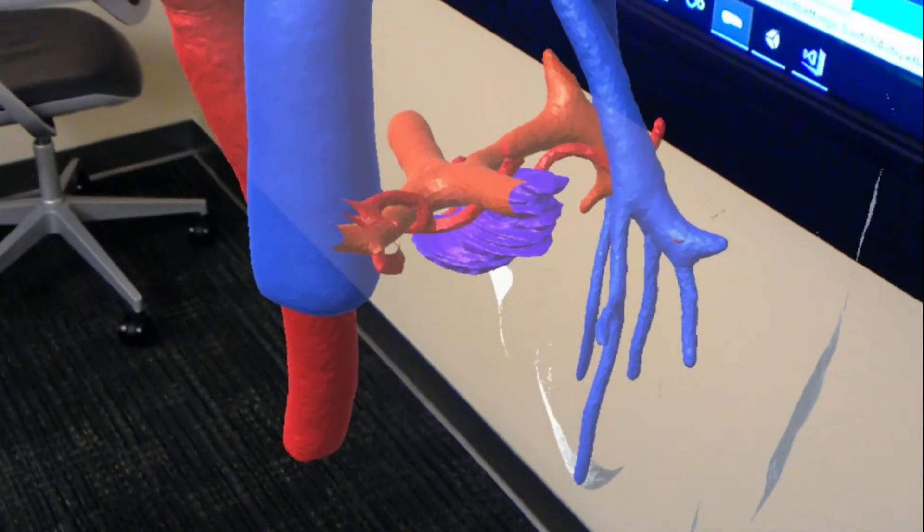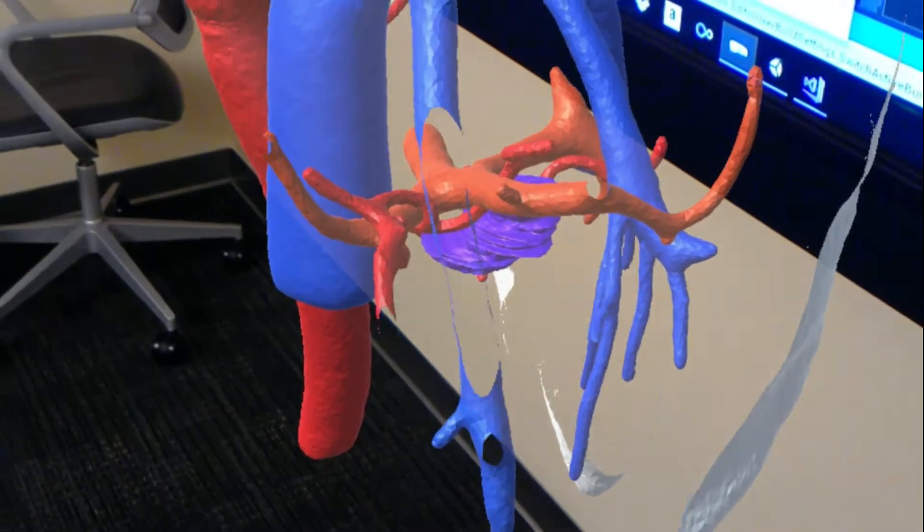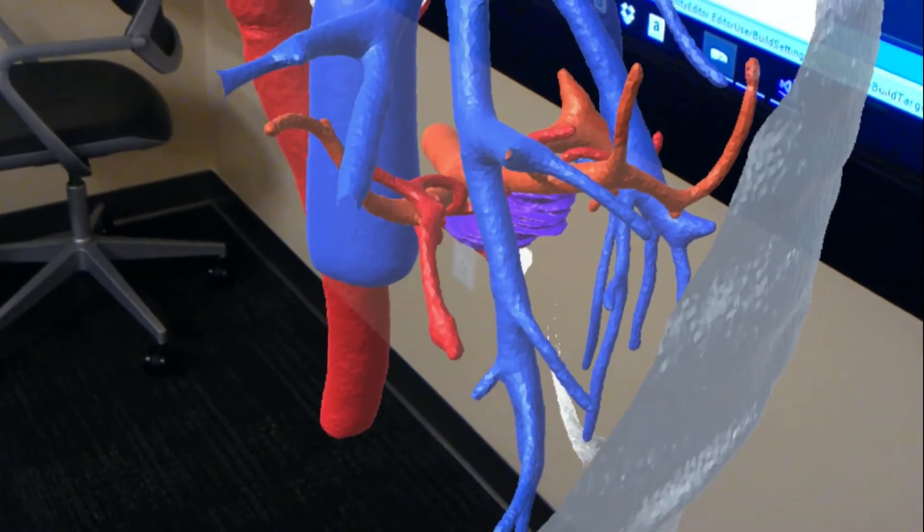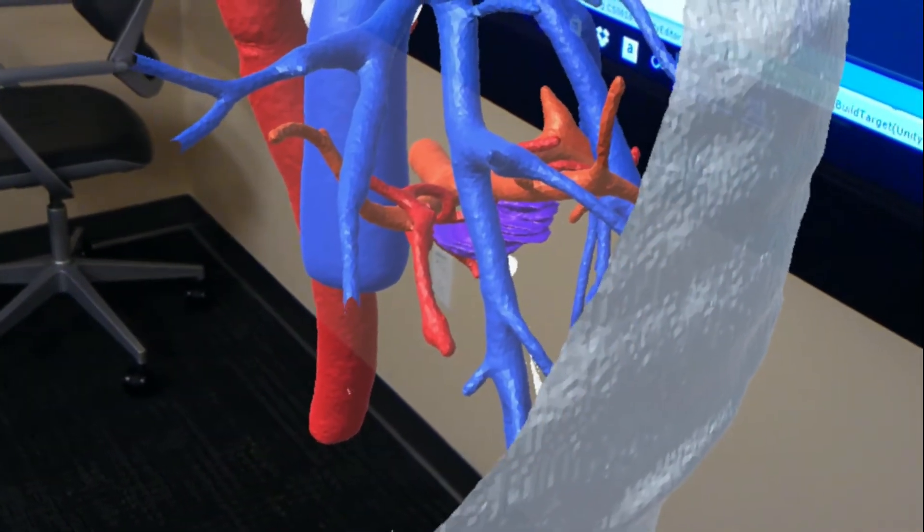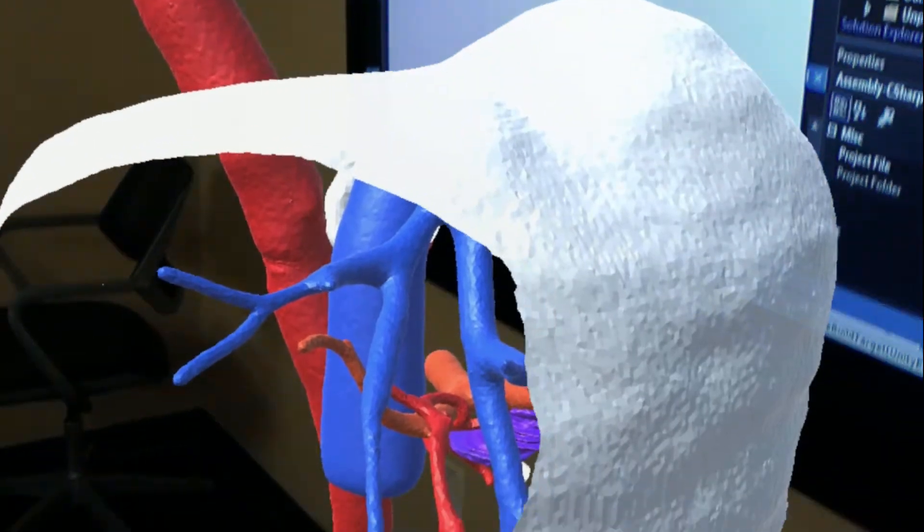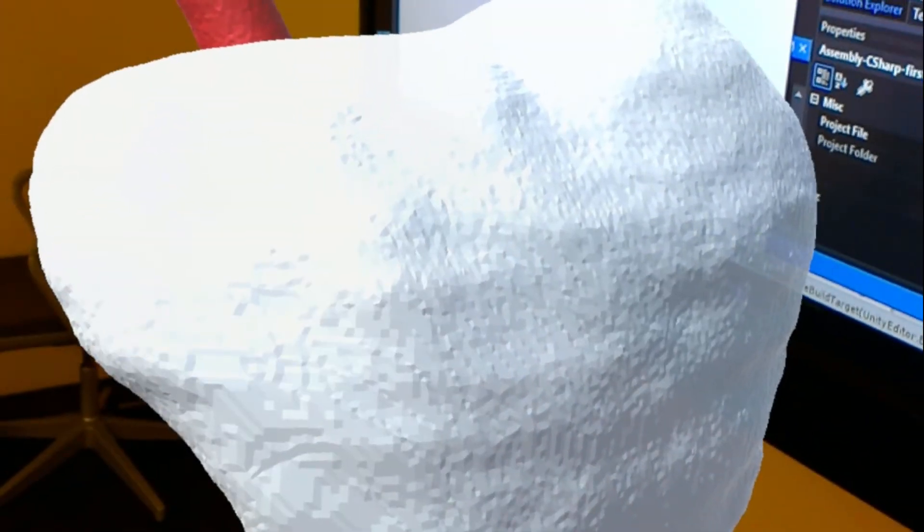We can see how it relates to the portal vein, which is orange, and the hepatic veins.